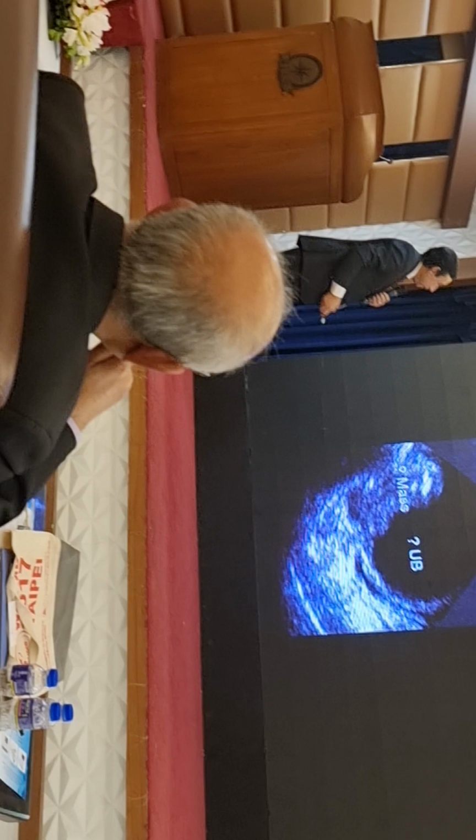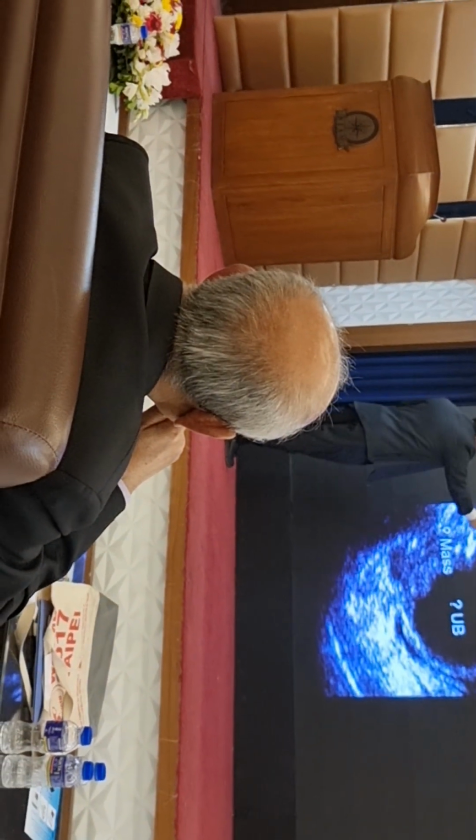And now here you can see another picture. This is urinary bladder. There is a mass.